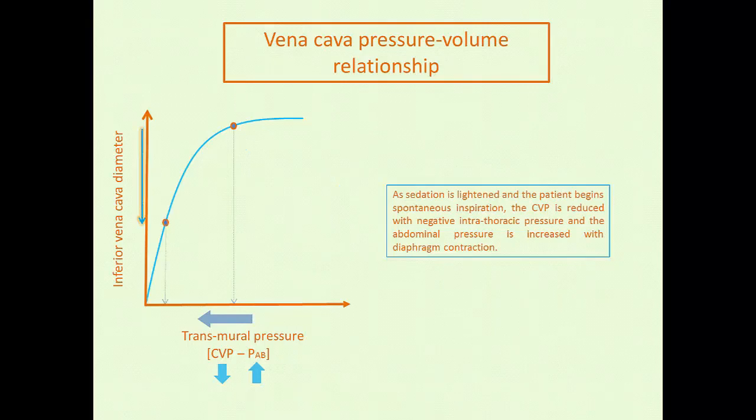So this patient, depending on really multiple factors, one of them being how active they are in inspiring, could have a pretty significant collapse in their IVC. But what I just told you was this patient is not volume responsive.